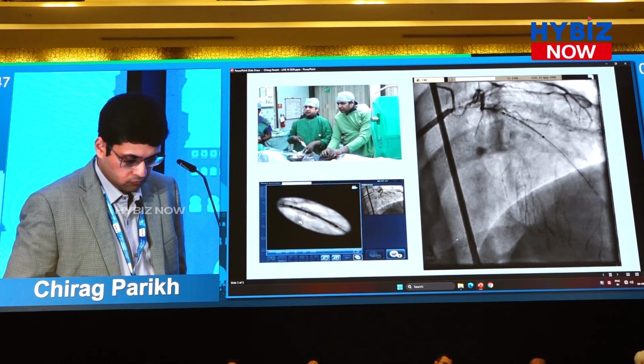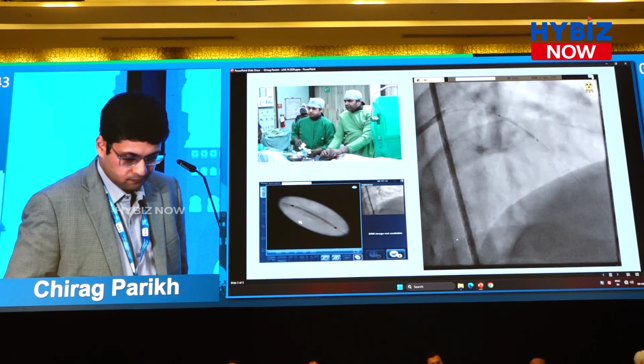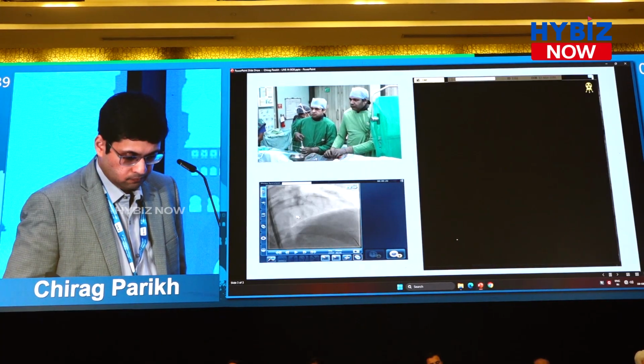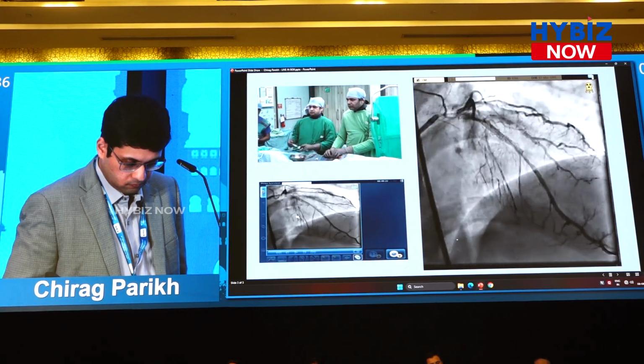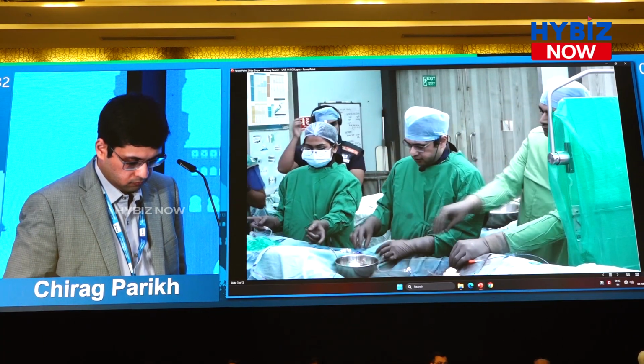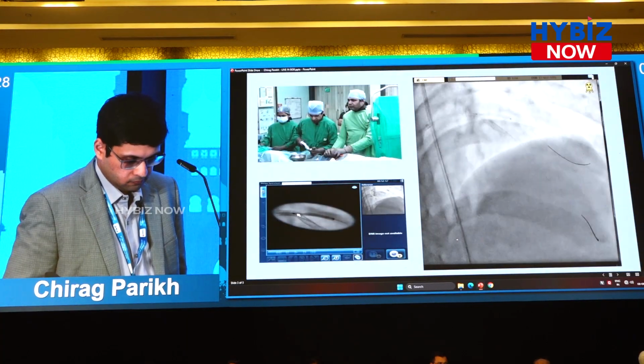I think I'm happy with this landing. To the 2.75 by 60 stent. So I'm at 12. Yeah, looks good. So we are now taking a 2.5 by 20 paclitaxel DCB into the diagonal branch, going to 8 atmospheres.